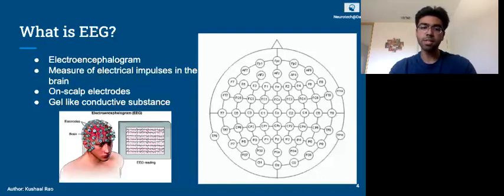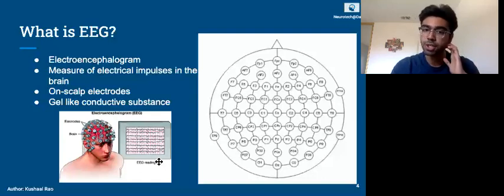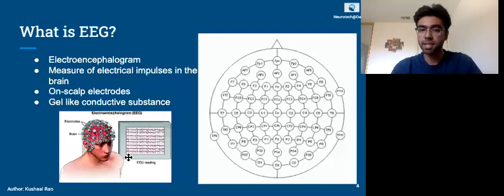If we put an EEG headset on someone's head and just made them sit there without doing anything, you would still see a bunch of activity. In fact, if you look closely at this picture, this is basically what you see when you're looking at an EEG headset. Every single electrode is picking up activity, and you'll just see 64 lines or 128 lines of microvolts. And it's hard to tell what that even means when you're looking at it in its raw form.